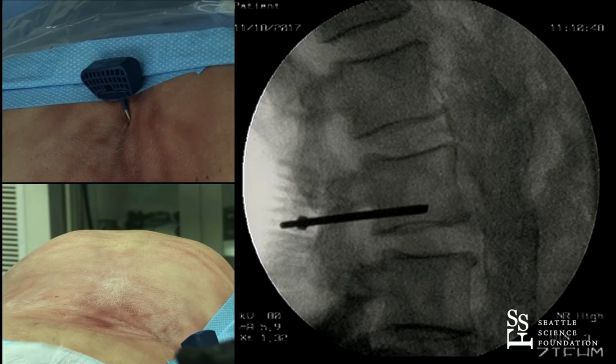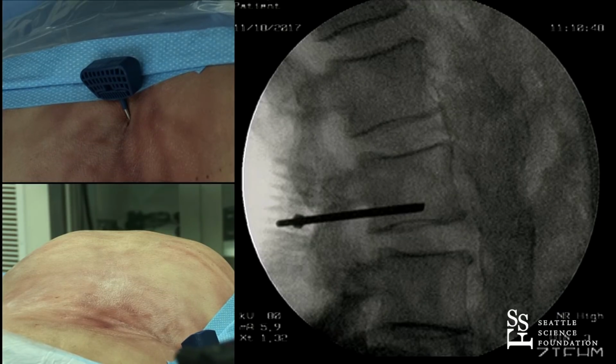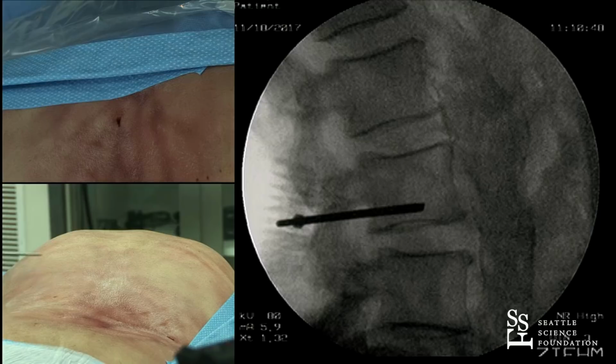And that's center anterior on the lateral and center on the AP view, and that's perfect position. So do you maybe want to try and do a cavity creation at this point? I think what we might do is I'd like to demonstrate a steerable needle, a steerable device. Somebody that takes a transpedicular approach, it's the most common. You can either go bilateral, or if you have a transpedicular approach and you're trying to get toward the center of the vertebral body and you're not able to do it for cement distribution or balloon inflation, a steerable device is very advantageous to do that. Steerable device makes average people better. So we will do that.